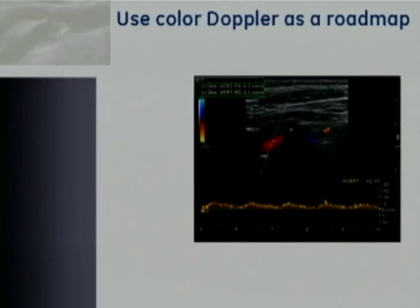This is an example of using the color Doppler. Here I'm in the vertebral artery, and it's an abnormal waveform with a very low velocity, only 6.2 centimeters per second. And you can see the waveform itself has a very delayed upstroke to peak systole. This is termed a tardus and parvus waveform. It's tardy to get to peak systole, and parvus, it's a small pulse.